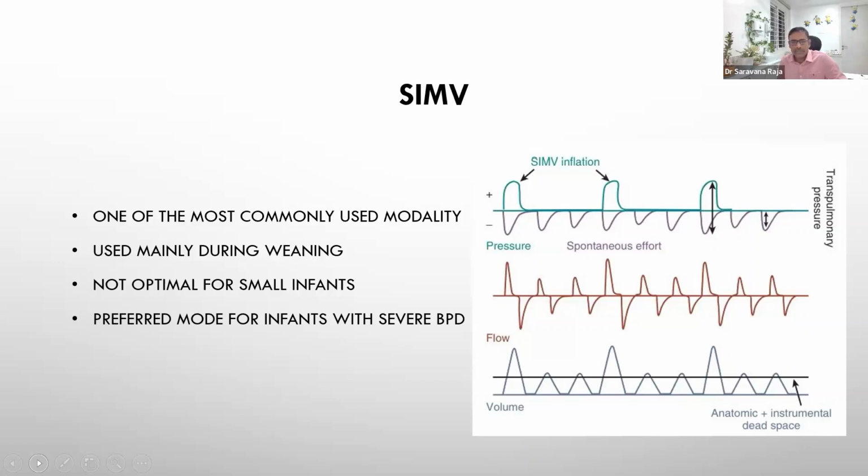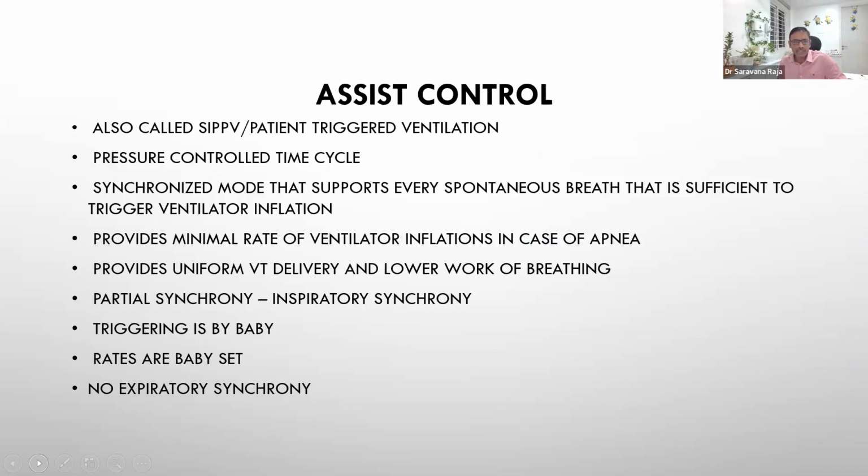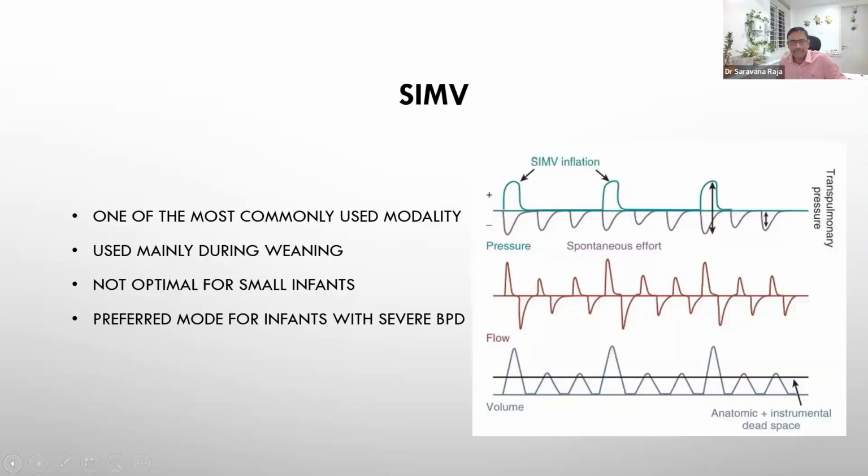And also, you can see from the volume one, when the baby's breaths are coordinated, you can see very good tidal volume. At the same time, with the spontaneous effort, the tidal volume is less when compared to the dead space volume. So it is one of the most commonly used modalities. Previous slide. It's one of the most commonly used modalities.